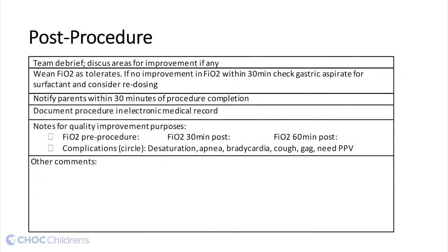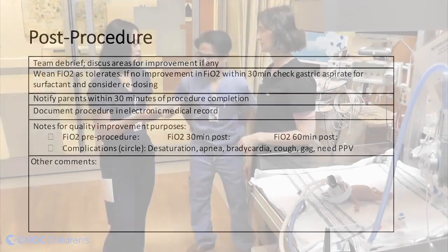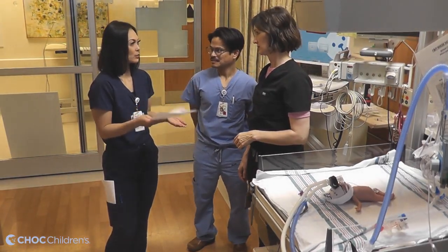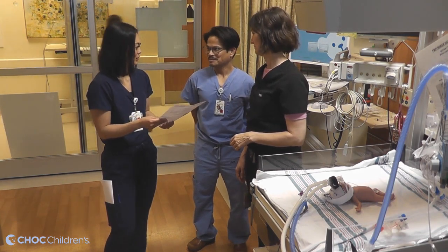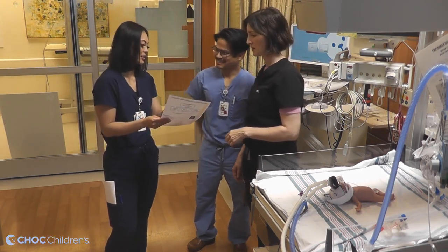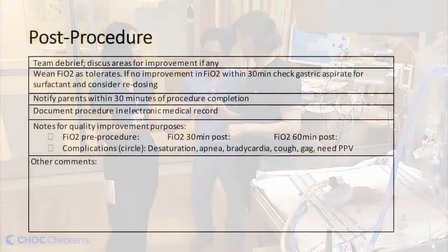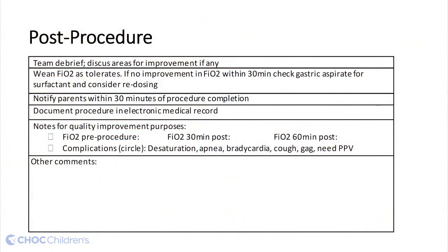Post-procedure. After the procedure is finished, the team will debrief and discuss areas for improvement, if any. This is the time to wean the oxygen as tolerated. If no improvement of FiO2 within 30 minutes, check gastric aspirate for surfactant and consider redosing.